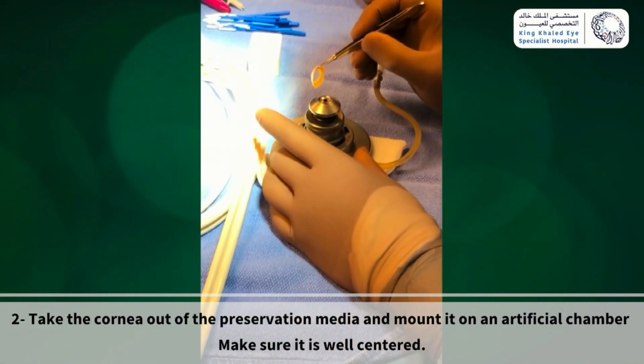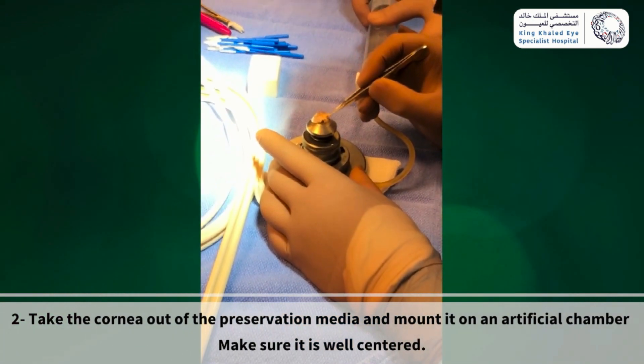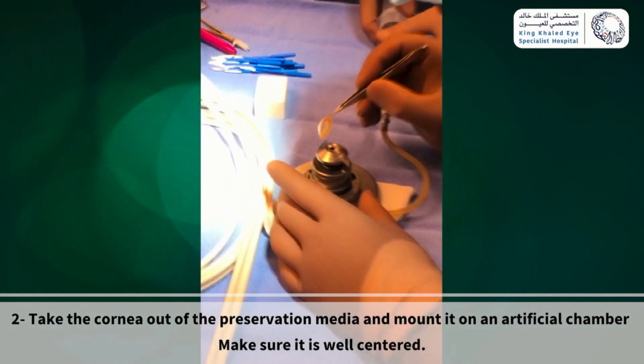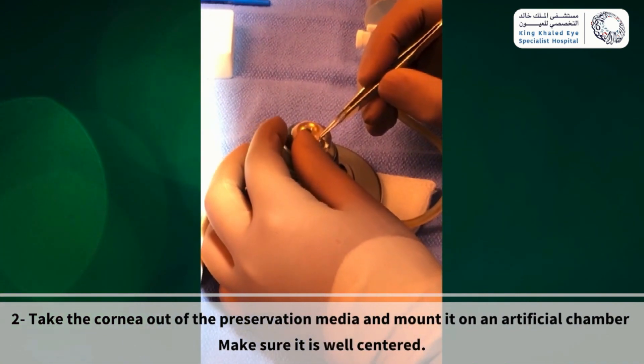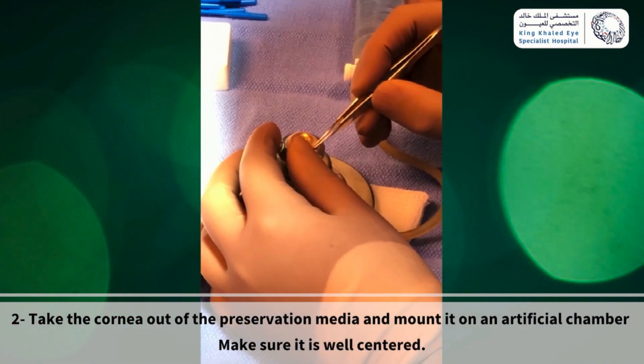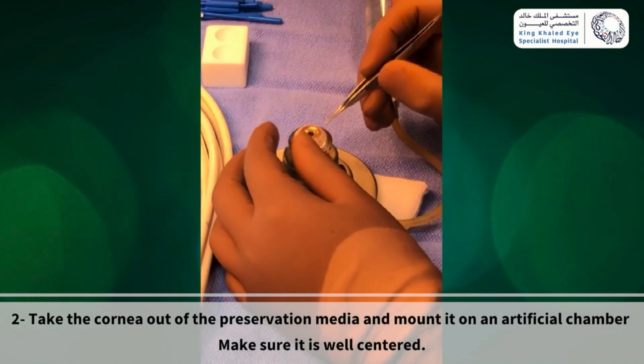Gently mount the cornea on the artificial chamber with endothelial side down. Have an assistant gently flush the system with BSS to remove all the bubbles beneath the cornea. Make sure it is well centered.